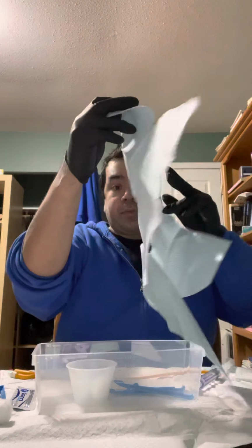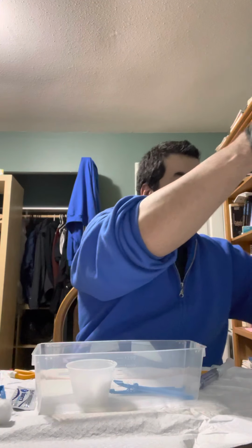I would then pick up the fenestrated drape, and I would lay it on the patient's perineum so that only the penis is exposed. I will then place a sterile tray on the sterile drape. The sterile tray contains cleansing medium, forceps, lubricant, and a pre-filled syringe to inflate the balloon.